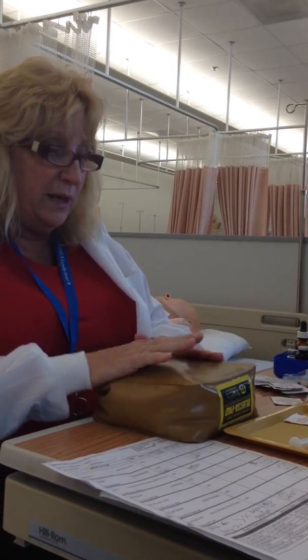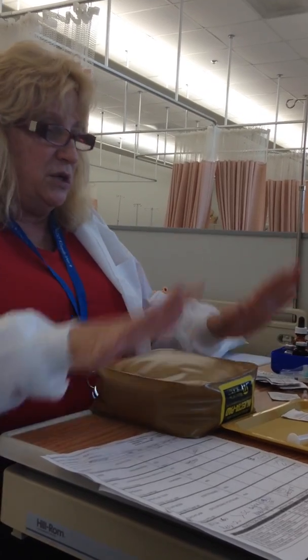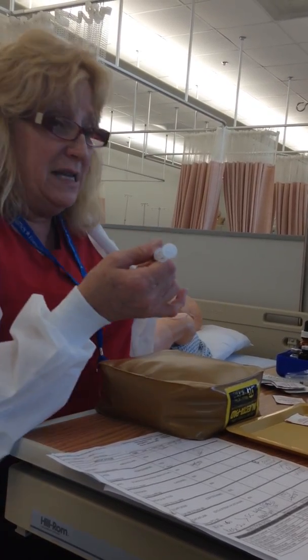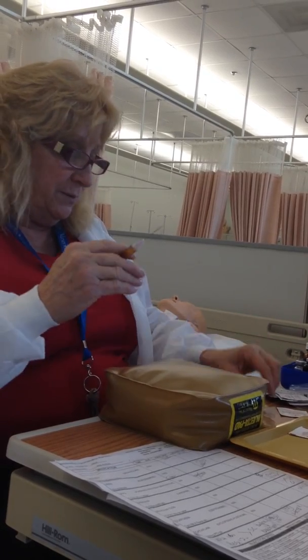This is the only mannequin we can put fluid in. So once I see you draw, I'm going to have you put the liquids back into the container. And then I'm going to see you do it with air into these mannequins. But this one, for just purposes of showing you.